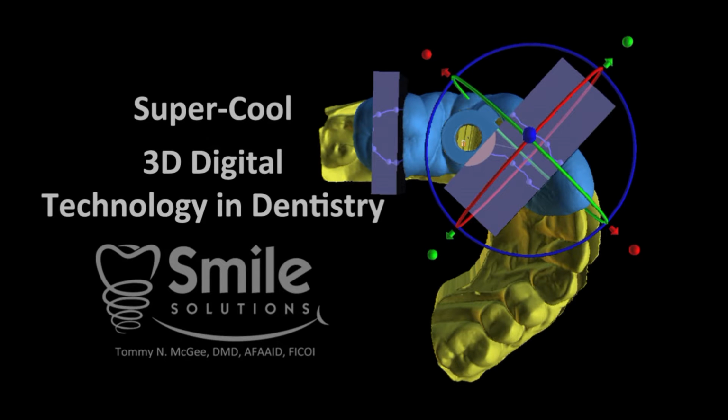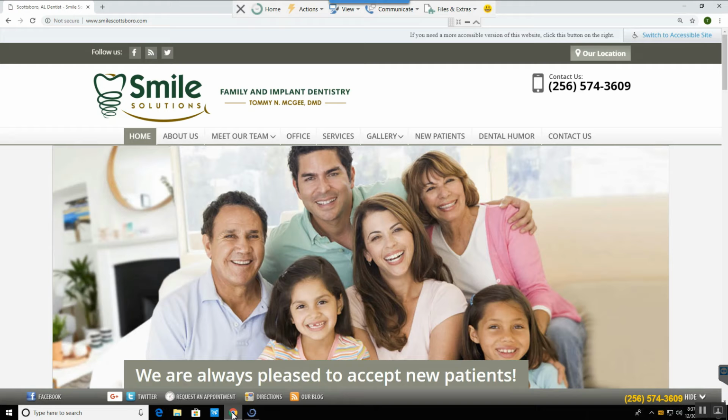Hello, I'm Dr. Tommy McGee, and I want to show you how we're using some really super cool 3D digital technology to plan and place our dental implants today.